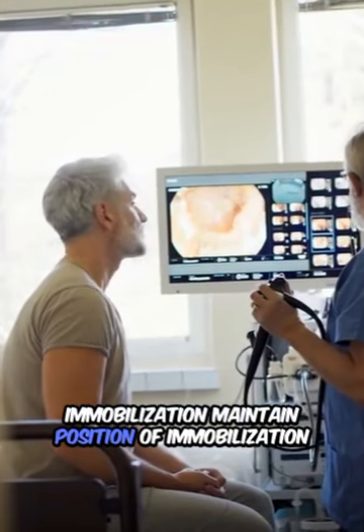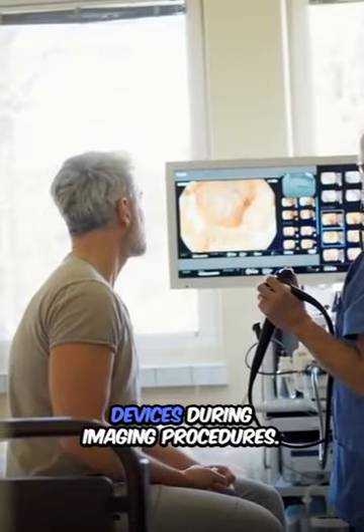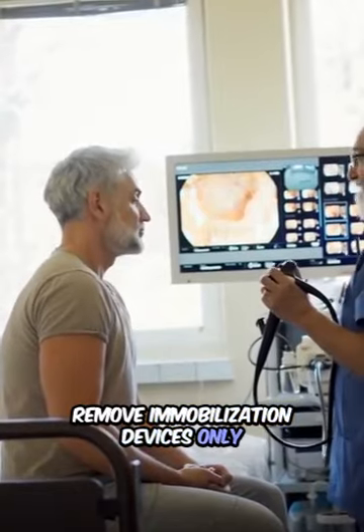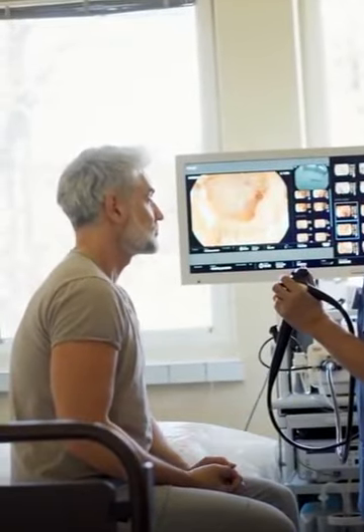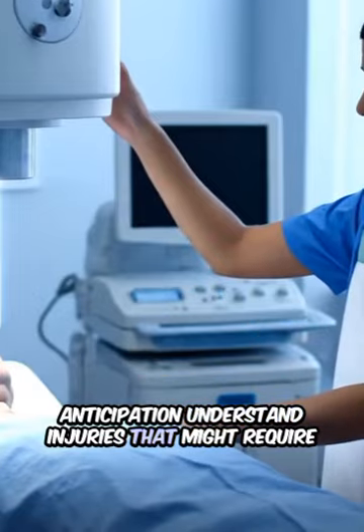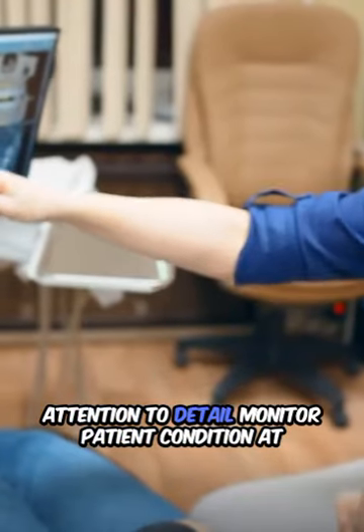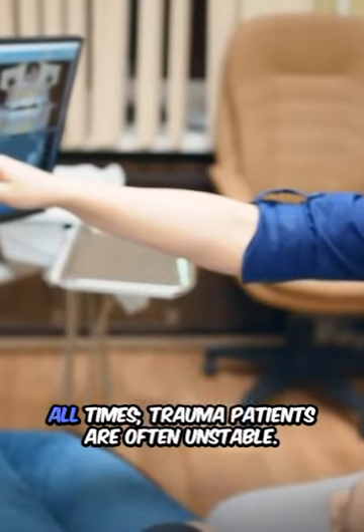Immobilization: maintain position of immobilization devices during imaging procedures. Remove immobilization devices only under physician's orders. Anticipation: understand injuries that might require special projections or diagnostic procedures. Attention to detail: monitor patient condition at all times.